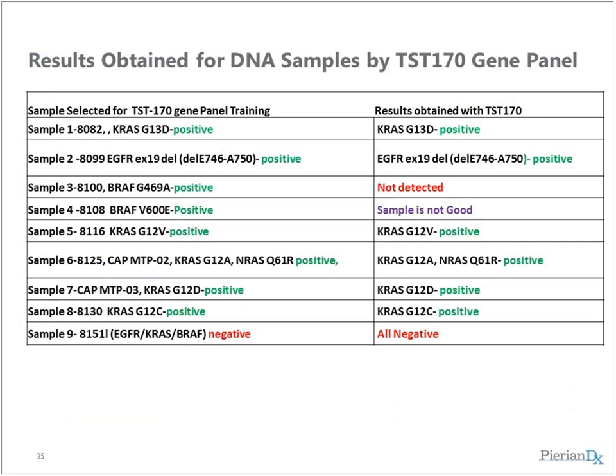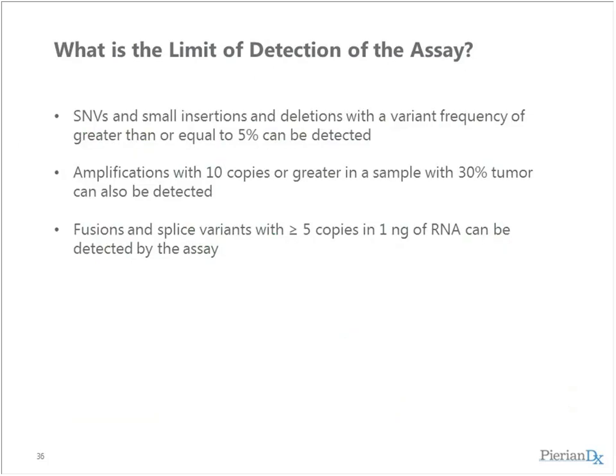We're in the middle of this, and we're hoping this panel will actually go live in the next week or two. So we've spent several months running through the recommendations of the diagnostic profiling article from the journal Molecular Diagnostics, and have run about 80 of these assays. And we're seeing very, very good results, which I'll show you as we go through there.